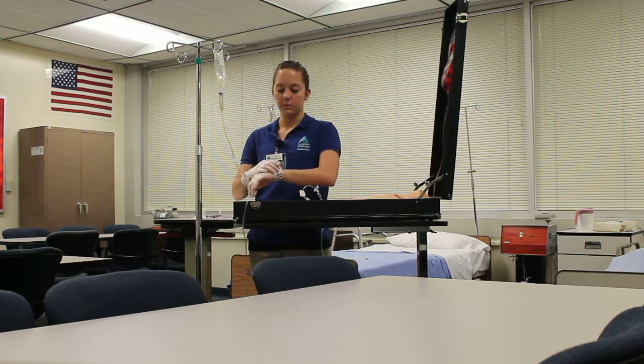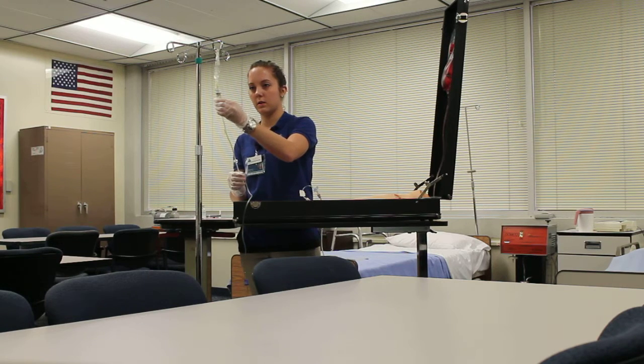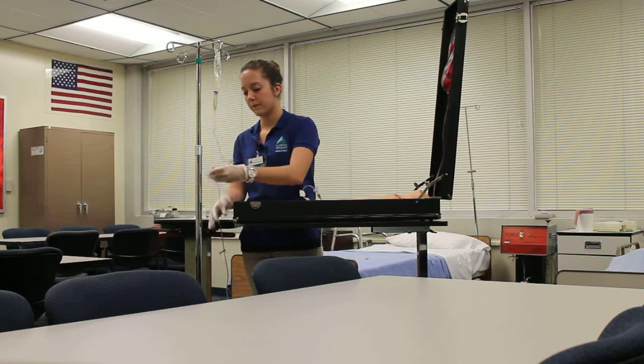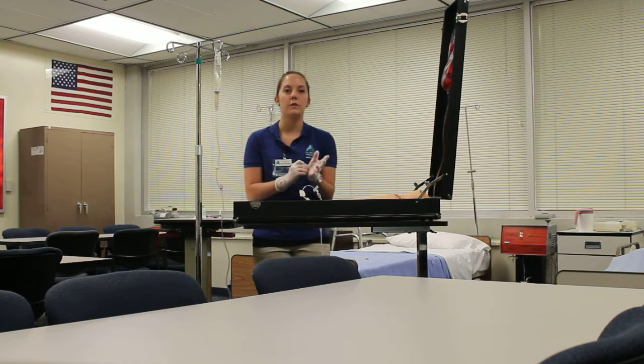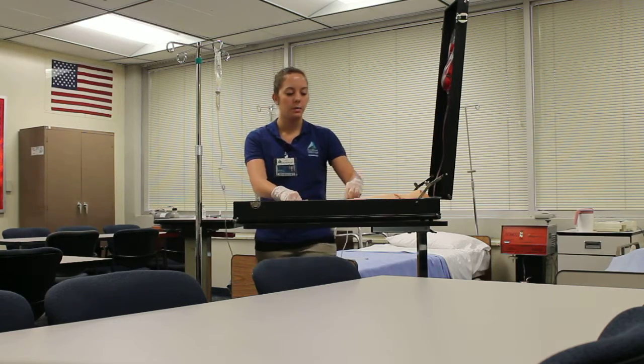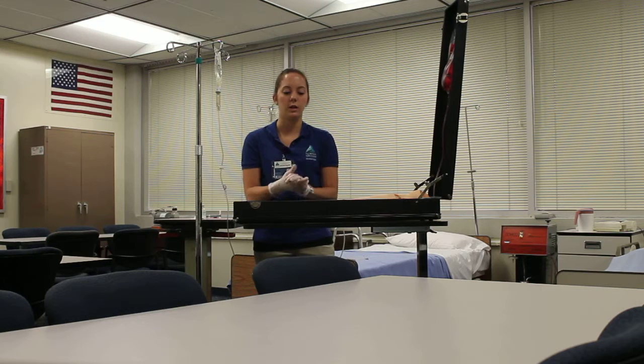So I'm just going to watch the drip chamber. Once I've done that, I'm going to let the medication run its course for over an hour. I'm going to come in periodically and check on the patient, make sure they're doing okay. I'm going to look at their IV site for any type of allergic reaction, phlebitis, or infiltration.